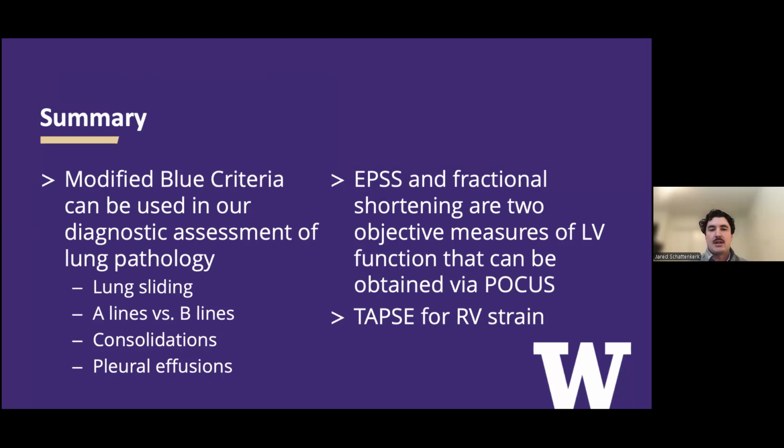And I think it's important to say that our point of care ultrasound shouldn't be a formal replacement for some of the more formal studies, like a formal echo. But if you're overnight or on the weekends when, say, you might not be able to get a formal echocardiogram, I think it can help in guiding your initial management while you wait for those studies to come back, and also help guide further workup and think, well, should I get a formal TTE, or do I need to get more advanced lung imaging as we think about the pathologies that our patients have.